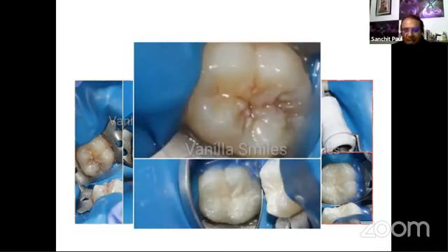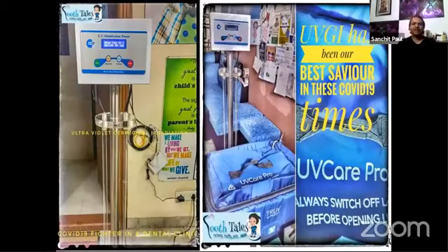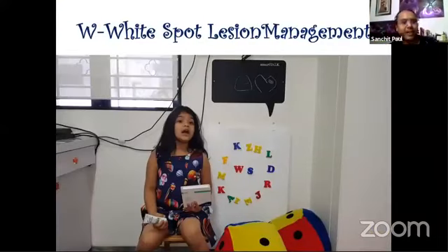So again, the aim is to get the anatomy in the best possible way and maintain it so that the overall outcome is always good rather than just doing a simple filling. I want to highlight the new UV thing, which we are now more used to and more familiar with, the UV GI. Again, this is something which we are now all well aware of. So just wanted to highlight another UV, which is with the letter U.